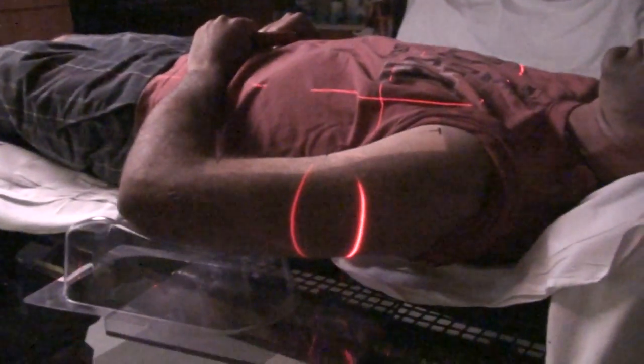All marks are on the same side of the fence — we're on. So now you've got a three-point in-line setup. Instead of a three-point setup where marks are on each side of the body with lasers lined up to them, we still have three points, they just go in a line. This allows us to be in line all the way along the course of the humerus. Then you set your depth — basically your SSD — and you're about ready to treat.